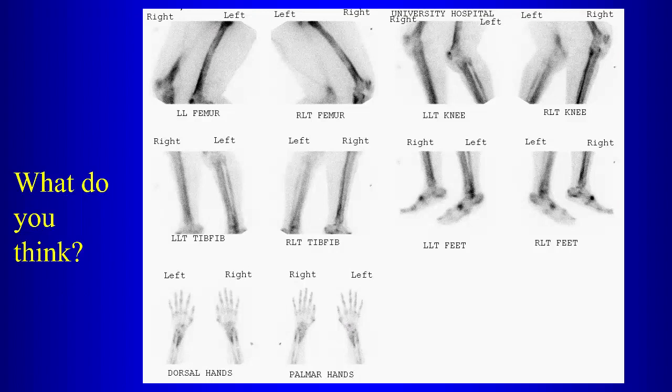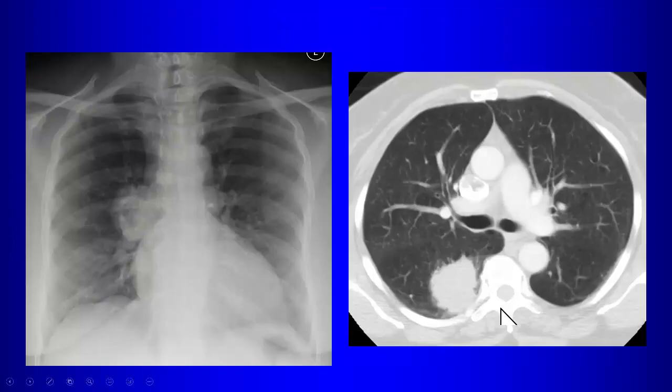Well, that doesn't help if it's an oral exam, does it? Hypertrophic osteoarthropathy. So what's the finding of the bone scan? Periarticular increase. The cortices of the long bones. Right. So these patients can present with bone pain, and you have increased uptake in the cortices of the long bone. So this is hypertrophic osteoarthropathy, and this can be associated with lung cancer.